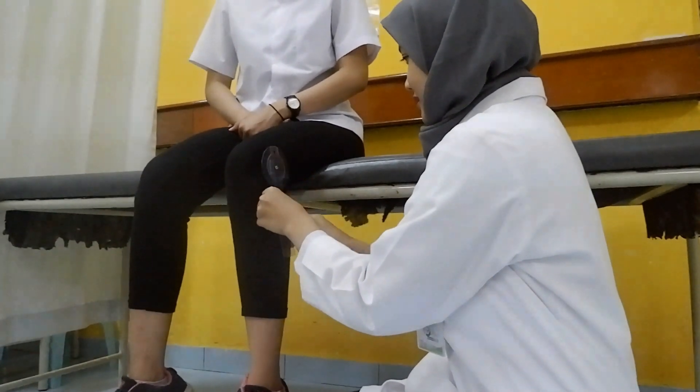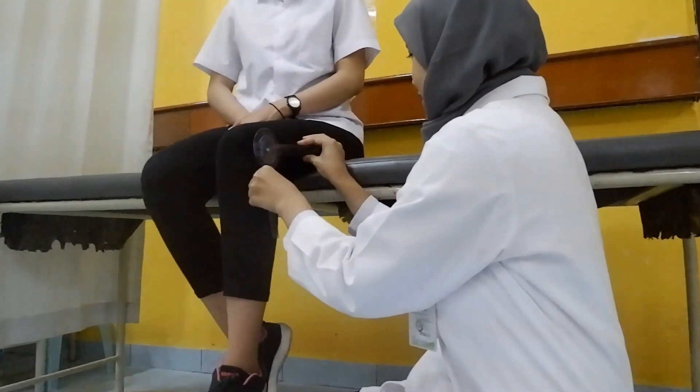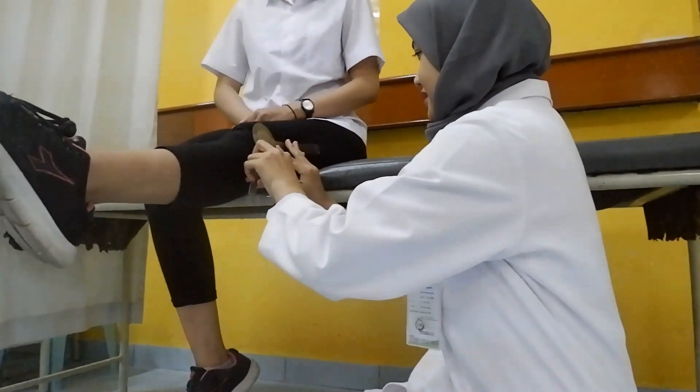Patient is in the sitting position and the examiner is beside the lower extremity that we're testing. The axis of the goniometer will be at the lateral condyle of femur with the stationary arm in the middle of the femur and the moving arm following the leg.